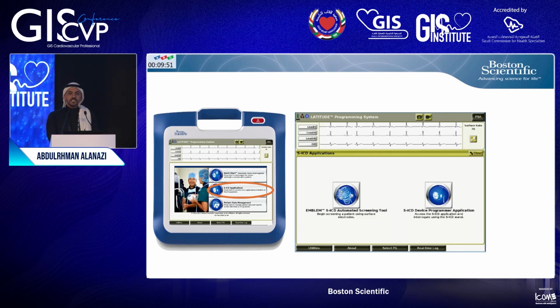The second one is the SICD application. You don't need anymore to have your small tablet with you to check the SICD device. We have the application in the Latitude 3300 now, and when you click that button, you will have the screening tool and the interrogation.